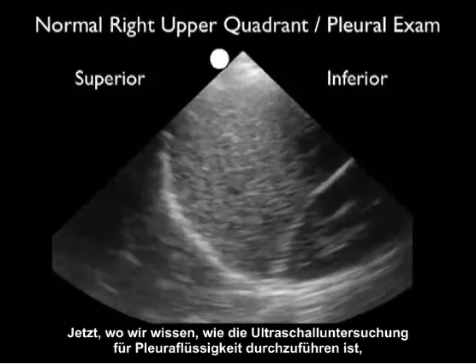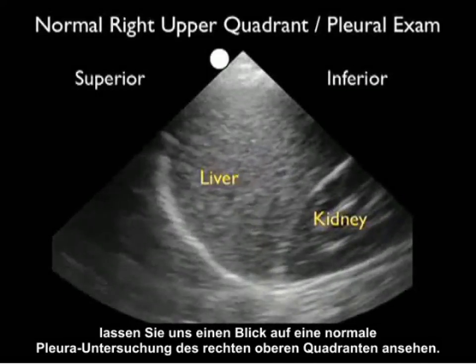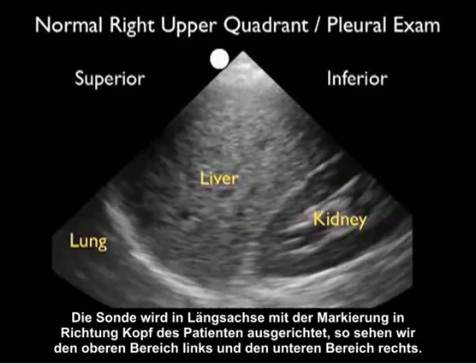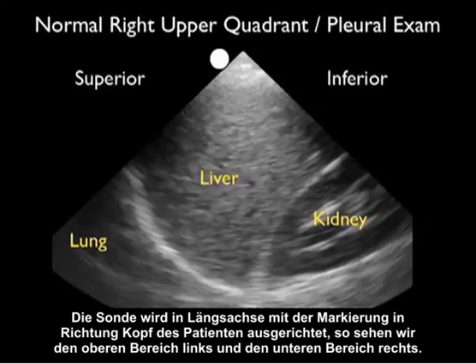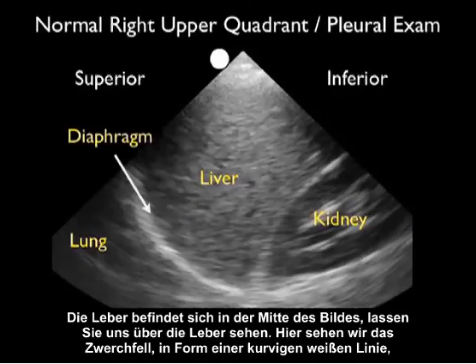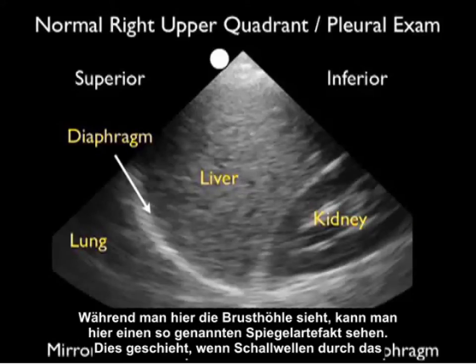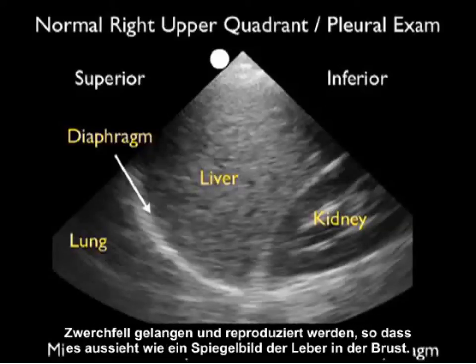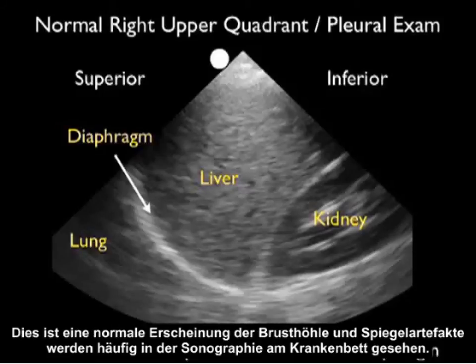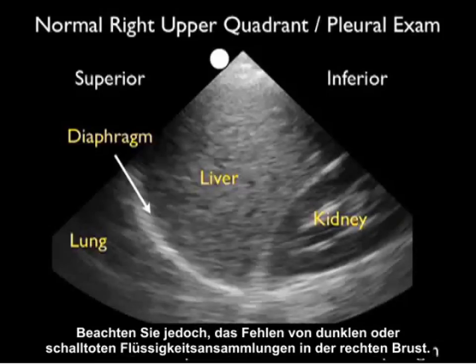Now let's take a look at a normal right upper quadrant pleural examination. The probe is configured in a long axis orientation with the marker towards the patient's head, so we see superior to the left, inferior to the right. The liver is in the middle of the image. Above the liver we see the diaphragm — that curving white line moving up and down as the patient breathes. Superior to the diaphragm is the thoracic cavity. What we see there is called mirror artifact, which occurs as sound waves pass through the diaphragm and reproduce what looks like a mirror image of the liver within the chest. This is a normal appearance, and mirror artifact is commonly seen on bedside sonography. Notice the absence of any dark or anechoic fluid collection within the right chest.